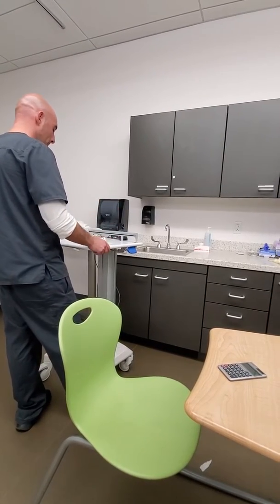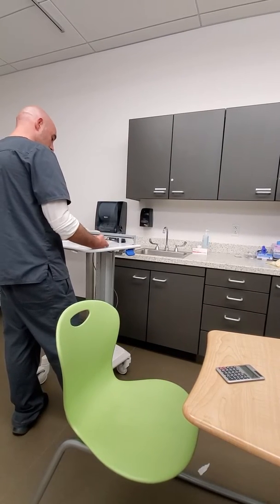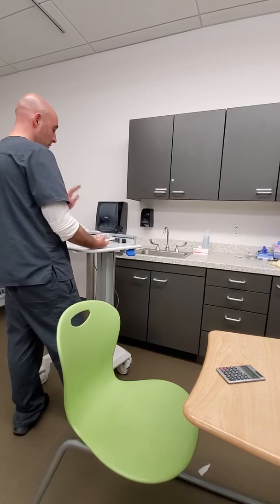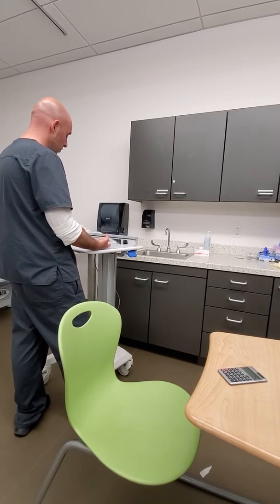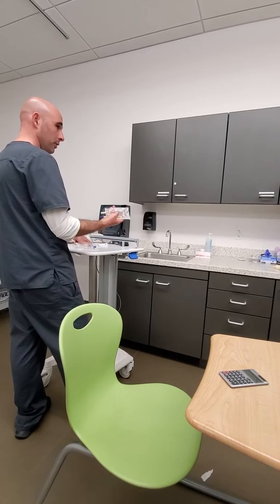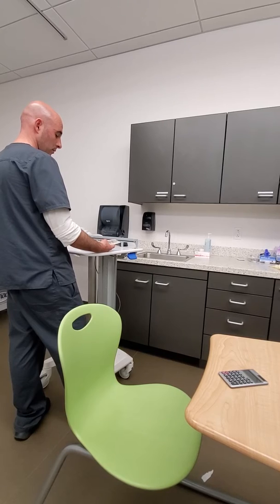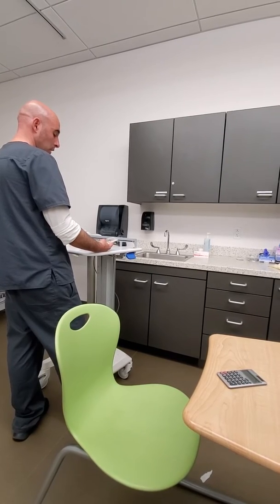And how do you know you have the right dose for this patient? I know I have the right dose because I have 100 milliliters here, and on my MAR it says I'm going to infuse 1 gram of Ancef in 100 milliliters. So you have 1 gram in 100 milliliters, but how do you know that's a safe dosage for your patient? Because the doctor ordered it?